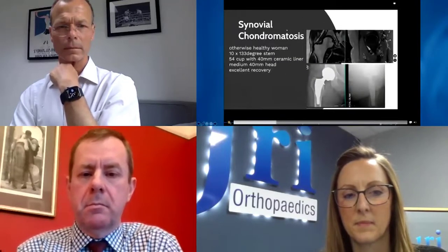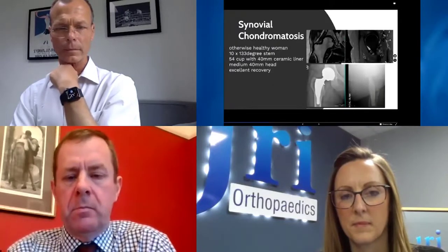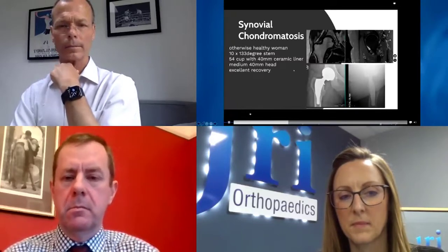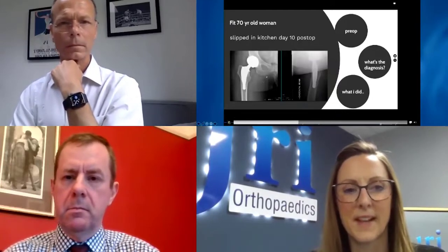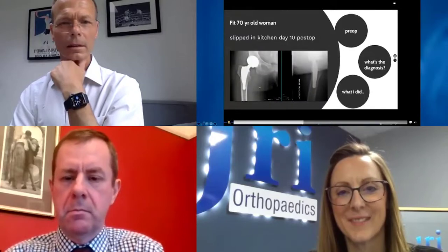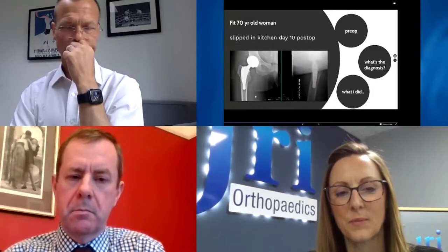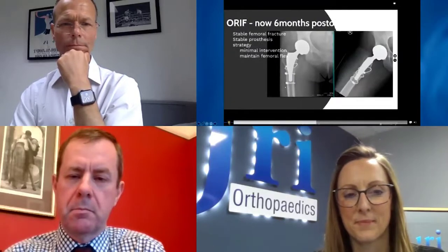And the preoperative diagnosis is synovial chondromatosis, otherwise healthy adult. I used a 10 by 133 degrees stem, 54 cup with 40 ceramic liner, medium head. She made an excellent post-operative recovery. That was the synovial chondromatosis lesions. So what's the diagnosis and what would you do? And maybe we'll pause there. From my point of view, I would say it's a Vancouver B1 fracture, because in the 10 days post-op, the prosthesis looks stable. We know this is a very benign device. And what I actually did was just use three cerclage wires. And she's now 6 months post-op.